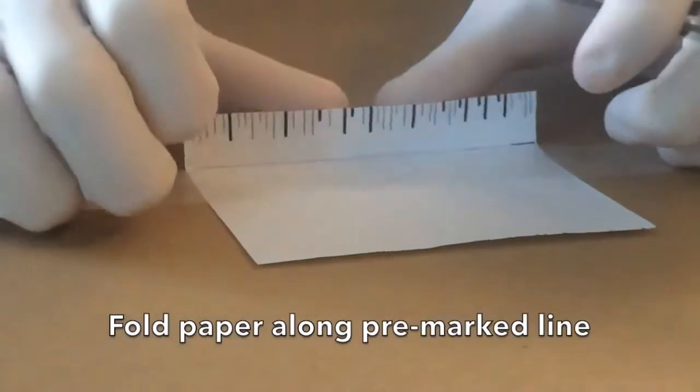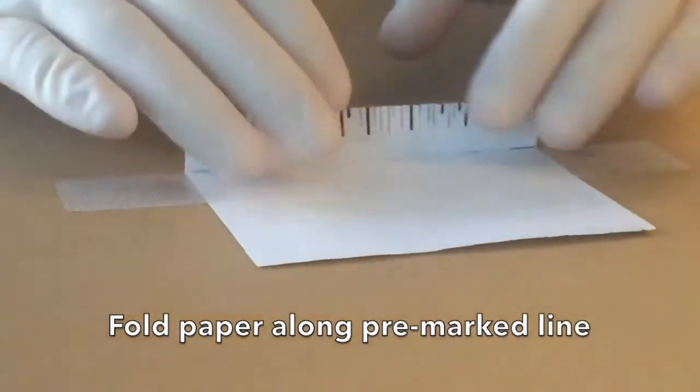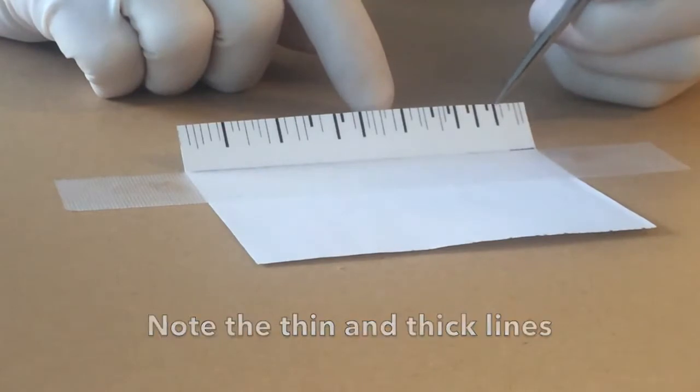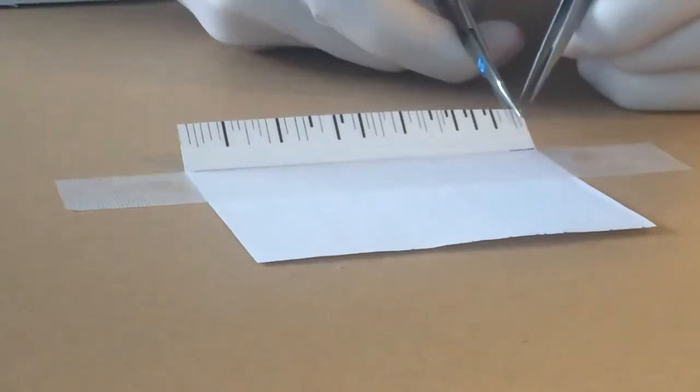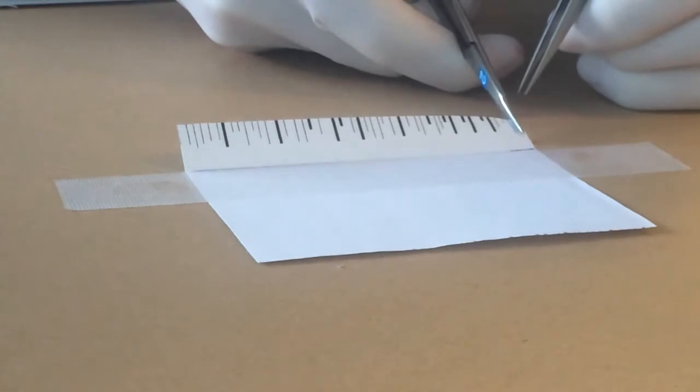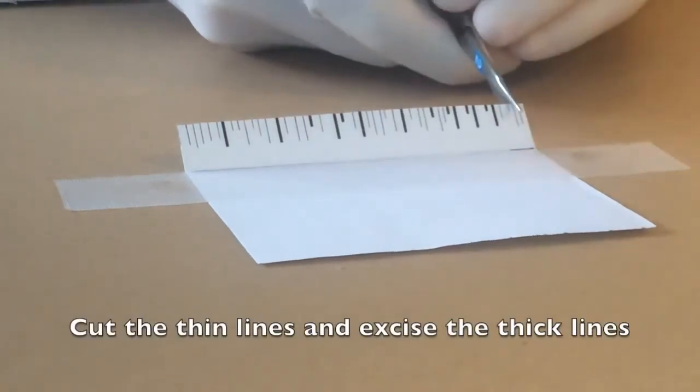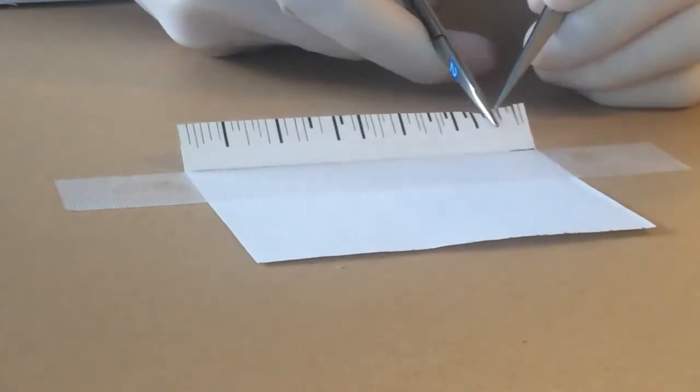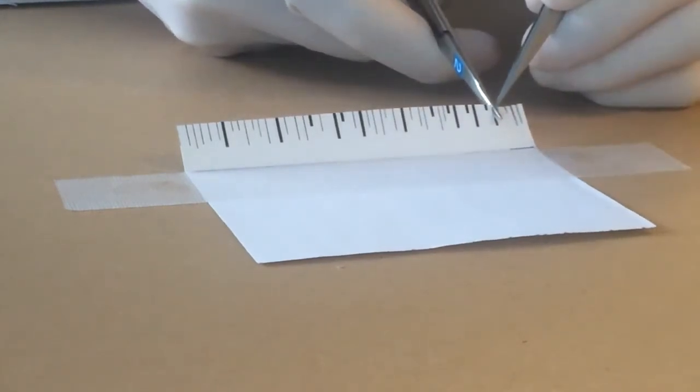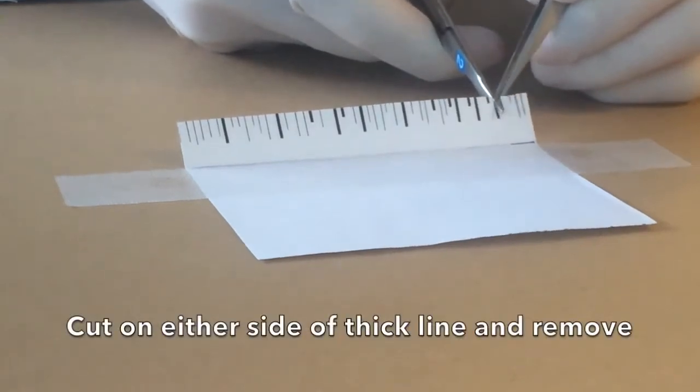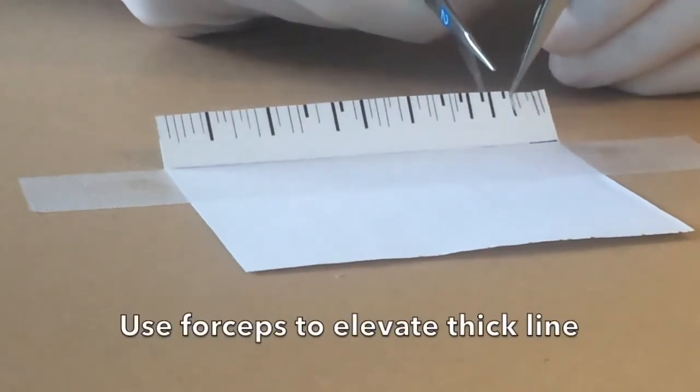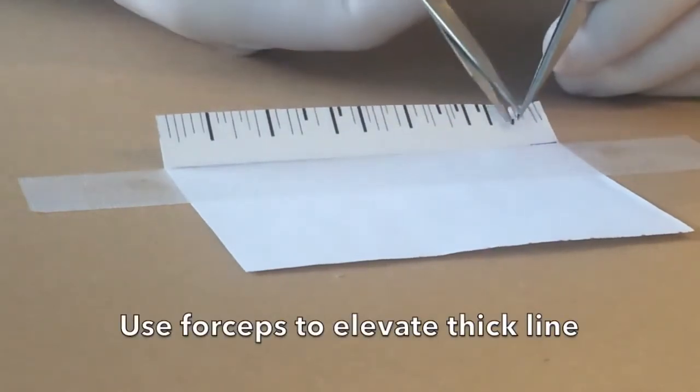The fourth exercise is scissor cut with removal. Again, fold the paper along the pre-marked line. In this model note the thin and thick lines. As in model 3, cut the thin lines with the micro scissors. In this model, excise the thick lines. Cut on either side of the thick line and remove. Use the forceps to help elevate the thick line.